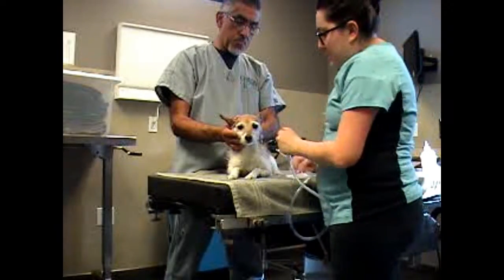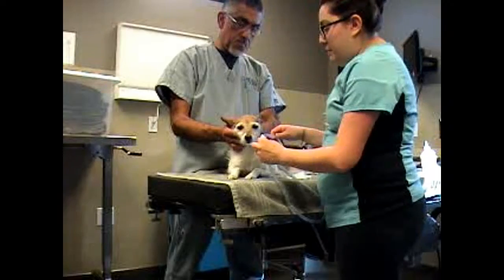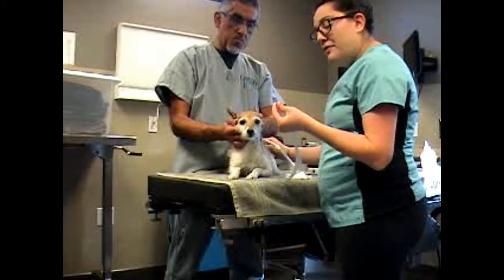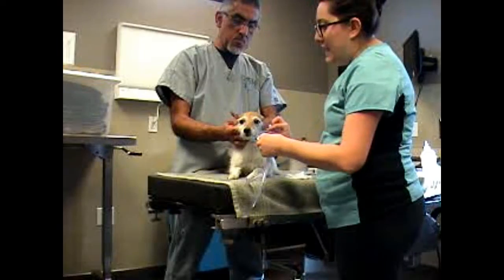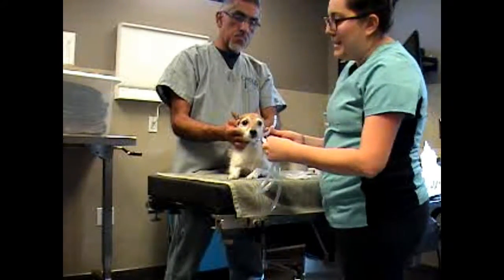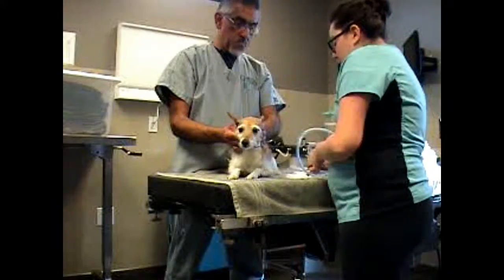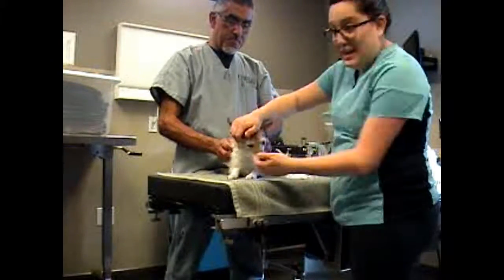But we would flush this, and we would listen for a cough in awake patients. Once we were ready to take out the stomach tube, we would want to clamp it off. Just press it in half as we're pulling it out, really nice and slowly. That way none of the fluid or medicine or anything that's in here could be aspirated back into the lungs. And once we have it out fully, we can unclamp it and we're good to go. So that was just a simulation of a stomach tube, since little Miss Phoebe didn't need one today.